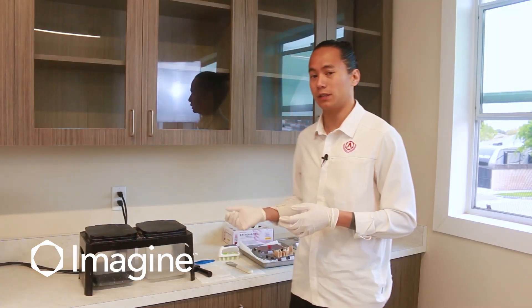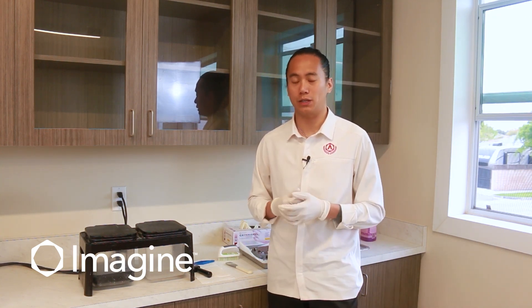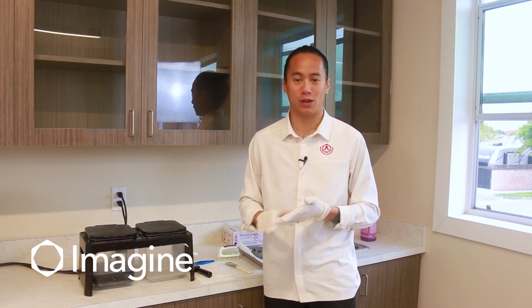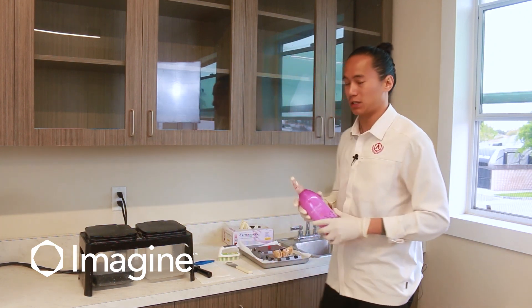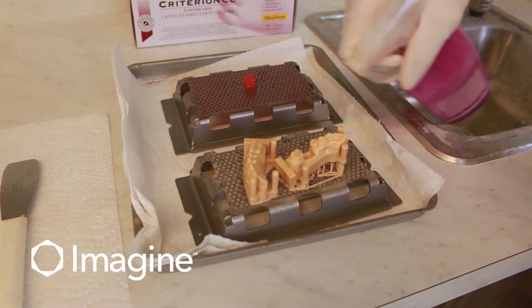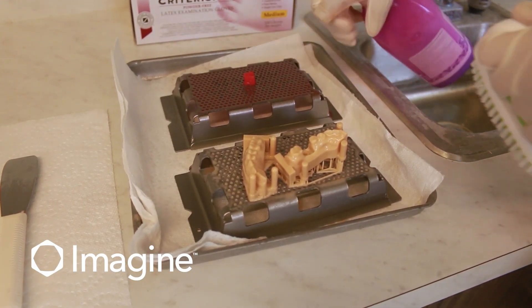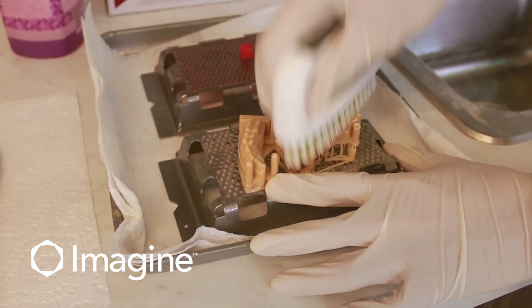Once your units are in the post-processing area, the first thing we're going to do is remove any excess material from the units themselves as well as the build platform. What we're going to use for that is a spray bottle with isopropyl alcohol and a brush. Just spray the build platform and units with alcohol and then gently brush all the way around.